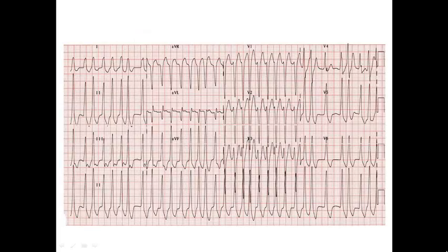Let's look at this ECG. We can see here that we have irregular wide complex tachycardia. We can notice that some of the RR intervals are extremely short — some are just one large square — so the heart rate here may approach 300 bpm. This is a very malignant rate, and this ECG is very suggestive of pre-excited AF.